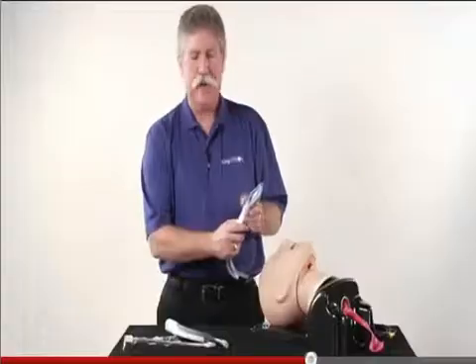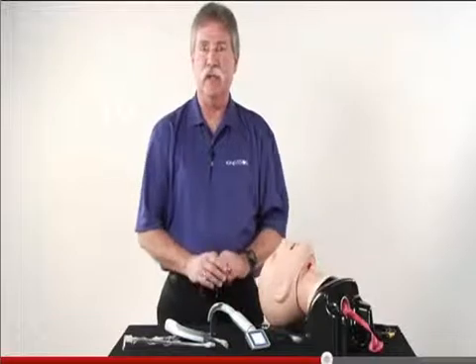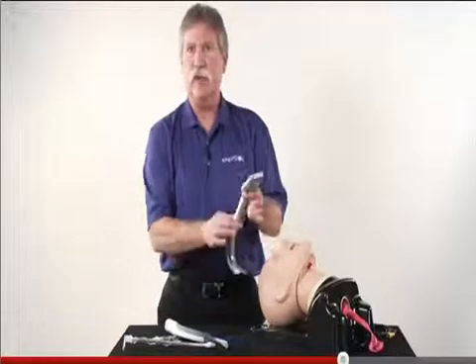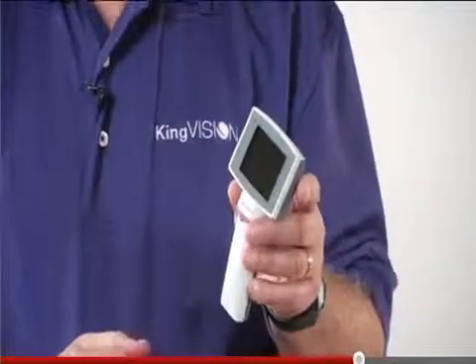There is an automatic shut-off feature that if you forget to turn the unit off and it sits there for a minute without any motion, it will shut itself off to conserve battery life. It's also such that once you disconnect the blade from the display, it also automatically shuts off.